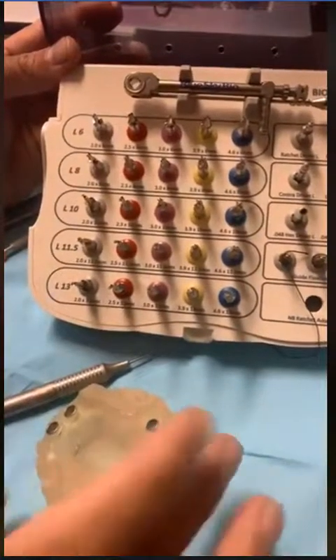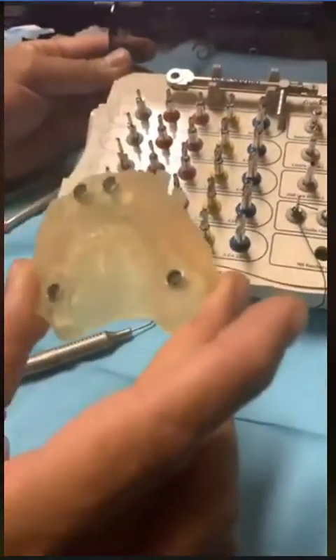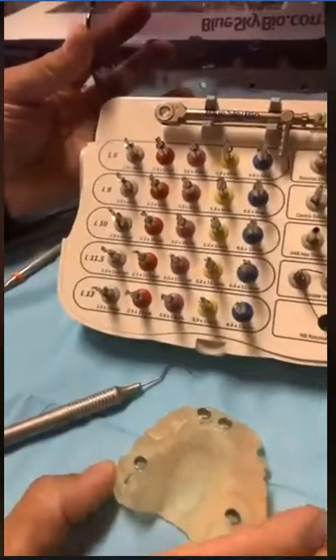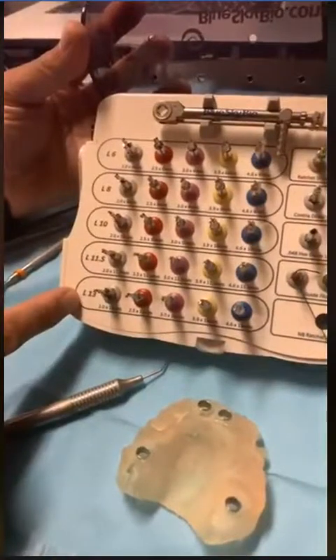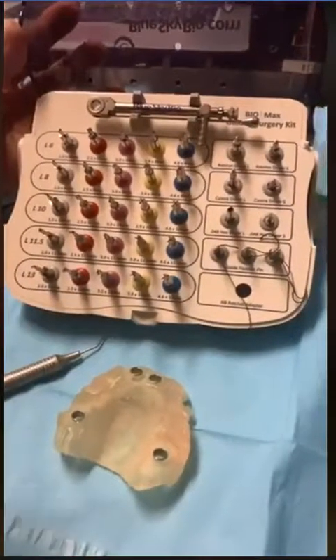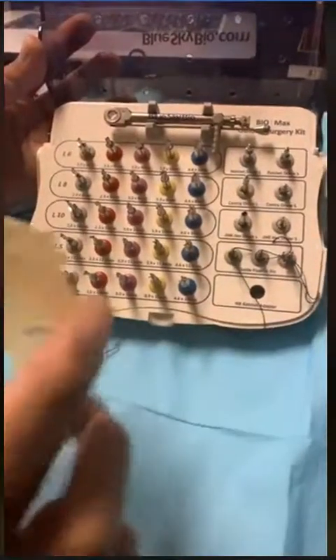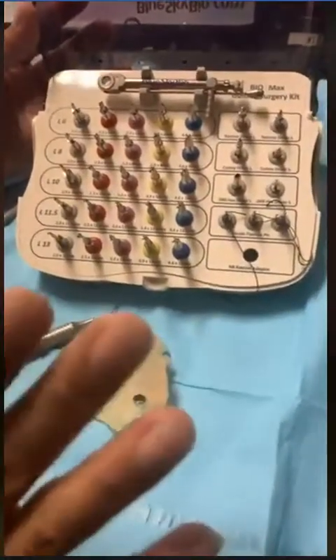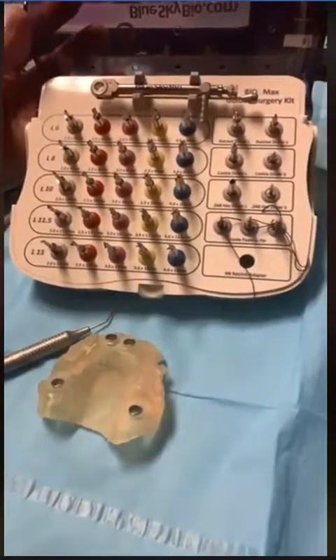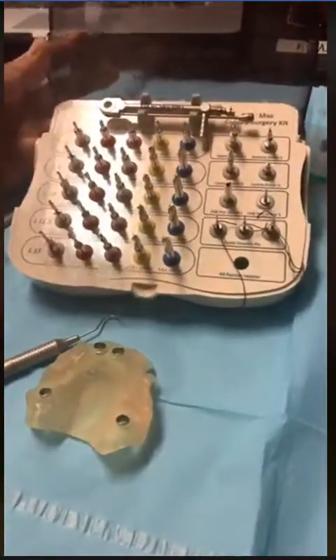Generally speaking, this is a kit that I used to do the surgery yesterday, but in this particular case, a patient got an MIS implant, okay? And an MIS implant has the same length and width as these. So it really matches very well for those of you who do MIS surgeries. Then this would work very, very well for you. You don't have to deviate from anything, except at the very end, you take the MIS carrying tool and put the implant through the carrying tool. So that's basically what it is.